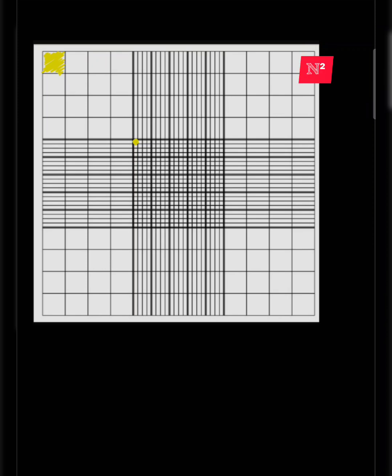The bigger squares on the four corners of the grid are called the WBC large square. Now these large squares are divided into 4 equal parts, both horizontally and vertically.